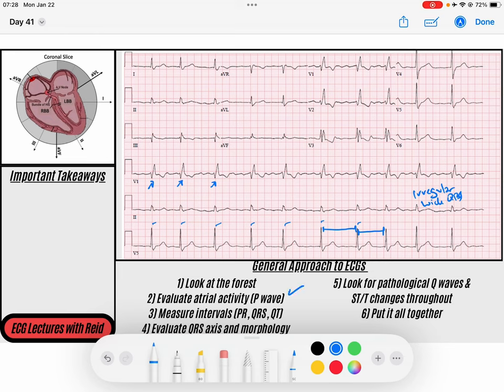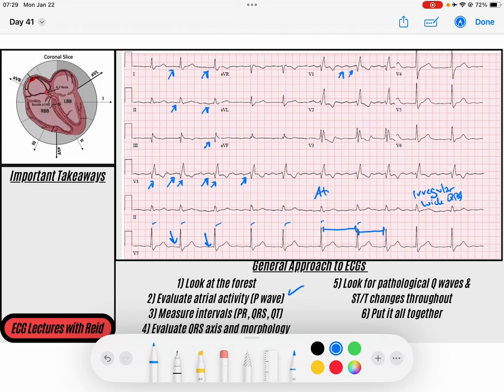The first thing I'm going to do is evaluate the atrial activity and see what my P waves are doing. I don't necessarily see any P waves as I start in the rhythm strips here. Looking at lead one, I don't see any discernible atrial P waves driving my QRS complexes. I see a fibrillatory baseline instead, which makes me think this is atrial fibrillation — there is no organized atrial activity, but there is a baseline fibrillatory pattern.